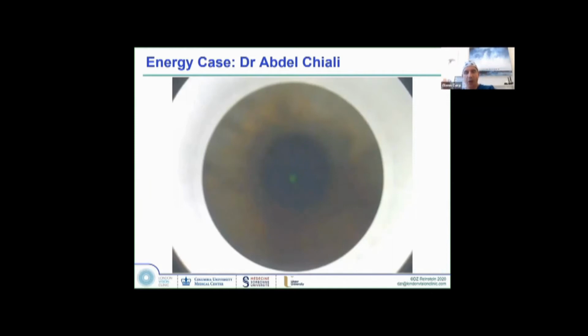What happened firstly is that he docked and he put his foot down, and there were practically no bubbles. No bubble formation in any of the picture. I'm going to show you the video in a second. So what's interesting is we're going to ask ourselves, was there enough meibomian oil on the surface of the eye that it actually blocked almost all of the bubbles being created in the first place? Or, and I hate to say this, but maybe there was a laser data entry error where the laser energy was just very, very low, or the spot spaces were very, very wide, that we didn't generate enough bubbles.